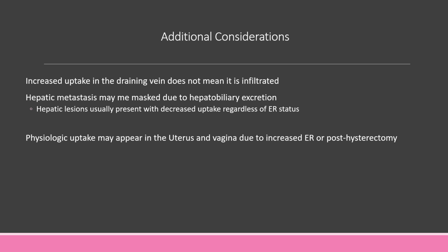Hepatic metastases may be masked on FES studies due to the hepatobiliary excretion, and hepatic lesions usually present with decreased uptake regardless of the ER status. And then physiologic uptake may appear in the uterus and the vagina due to the increased presence of estrogen receptors in that area, or if a patient has had a hysterectomy in the past, they may show up there as well.